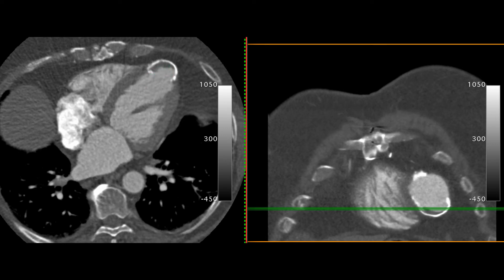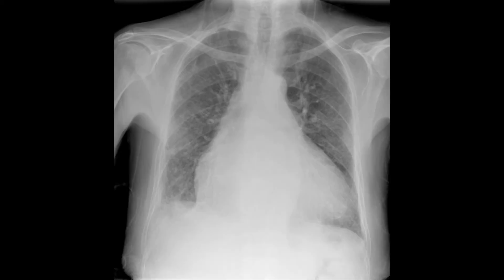Most aneurysms are caused by a full thickness myocardial infarction. Here is another more subtle left ventricular aneurysm — you can see some rim calcification here. Note the heart is enlarged and there is a right pleural effusion with some changes of upper lobe blood diversion due to cardiac failure.